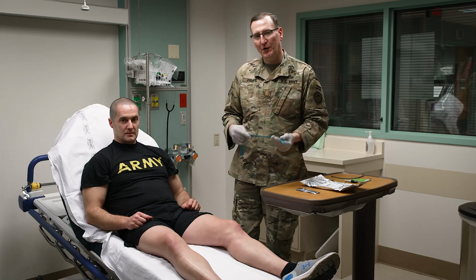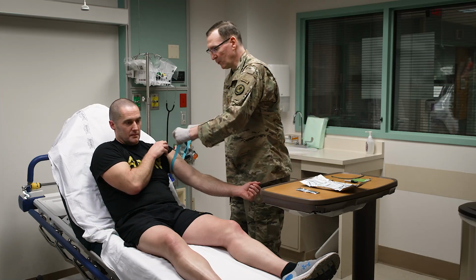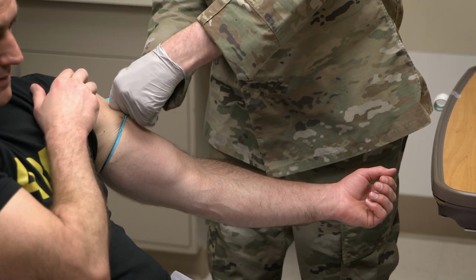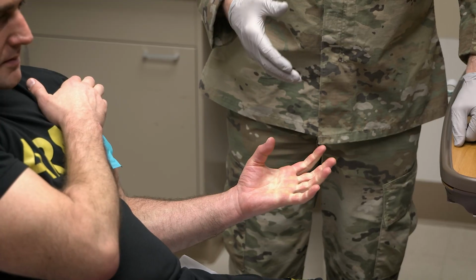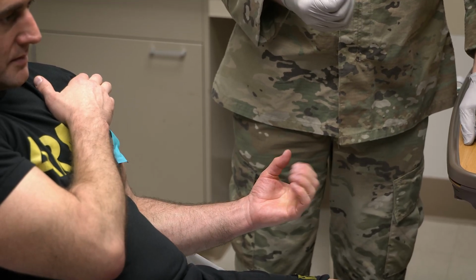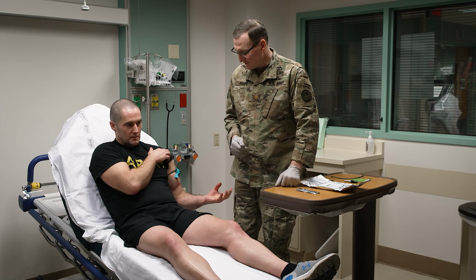All right, so we're going to start our donation process here. Just like any sort of process where you do an IV, or you're going to start a saline lock or whatever it may be, you want to apply a constricting band on the upper arm. You want to make sure it is nice and tight. You can have your patient clench his fist or her fist to see if you can get a little bit of veins to pop out, a little bit easier to see.